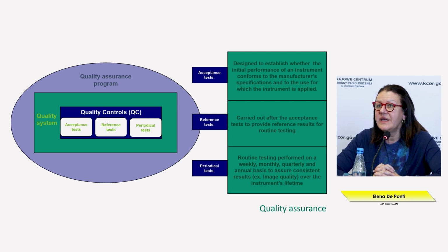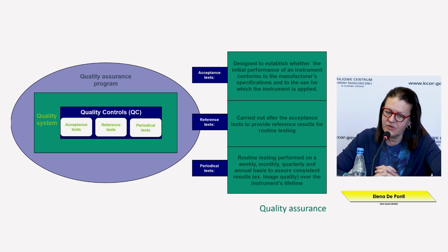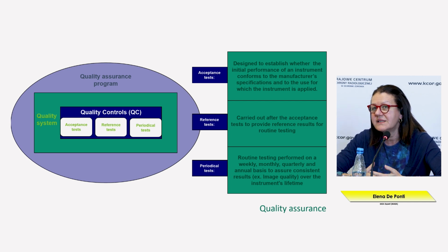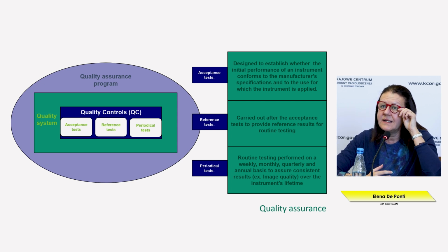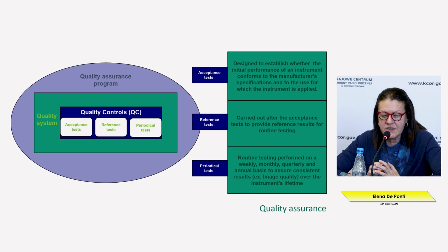So when we talk about quality tests, we have to underline that they are not a single task of a medical physicist, and that's enough. No, the quality controls are a part of a bigger concept, that is the quality assurance program.